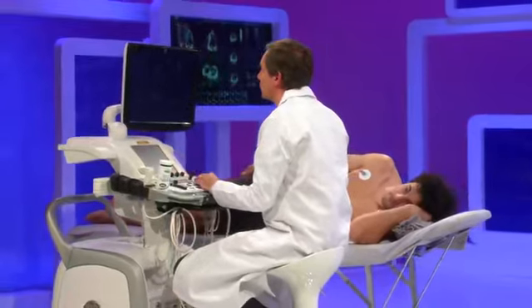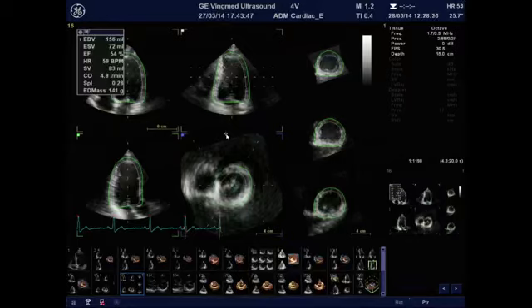Of course, this is also a very useful tool that we can use from the same data set. We can also measure the mass. And of course, this is much more appropriate than just measuring 2 walls. If you have, for example, a huge hypertrophy at the apical level, you will miss it just measuring in B mode or in M mode. So this will give you automatically the mass, and is of course also of added value compared to 2D, and is much more reproducible and compares very well with cardiac magnetic resonance, which is the gold standard actually.